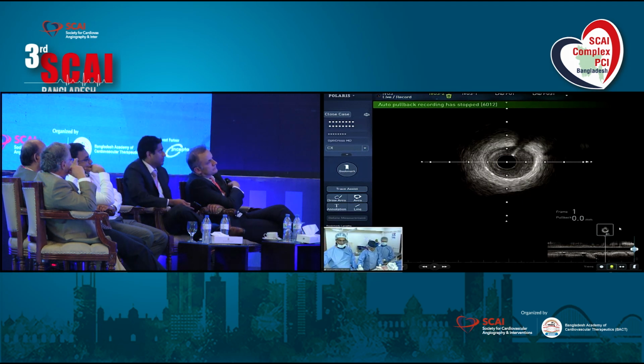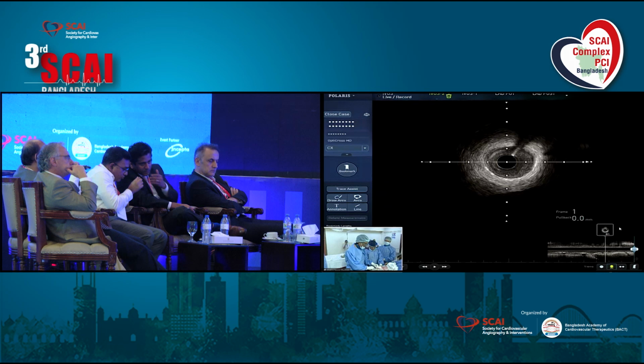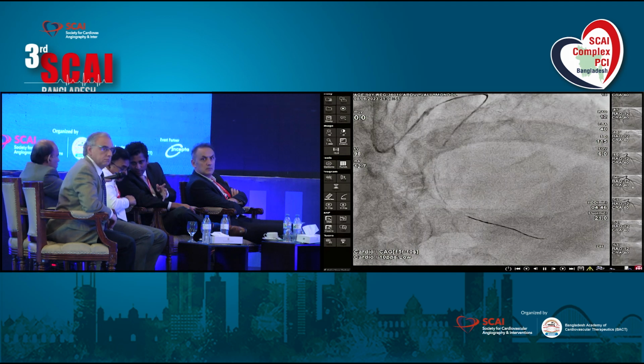Okay, thank you very much. We'll take one final angio to show you. Can you go back to angio, please, for them? Dr. Omar, you have a comment, please. Dr. Omar has one comment, right, Omar? Yes.